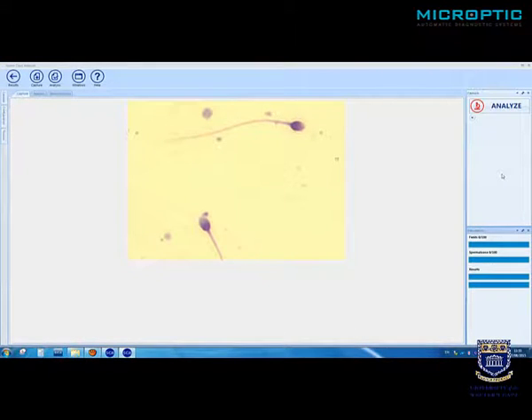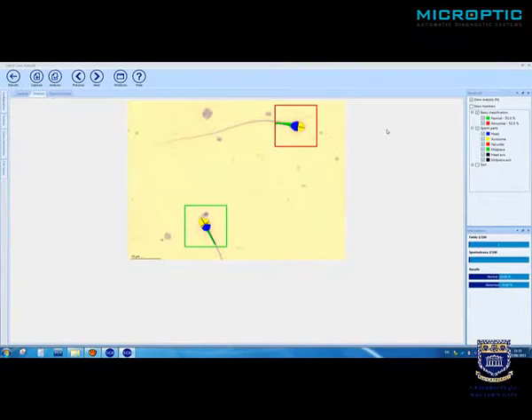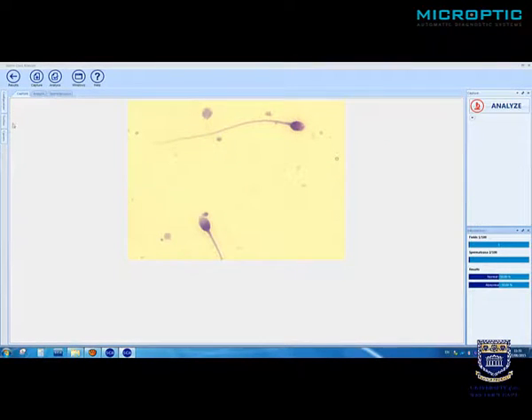We're focusing there on sperm stained with Sperm Blue. We analyze. And we can analyze just one more field.